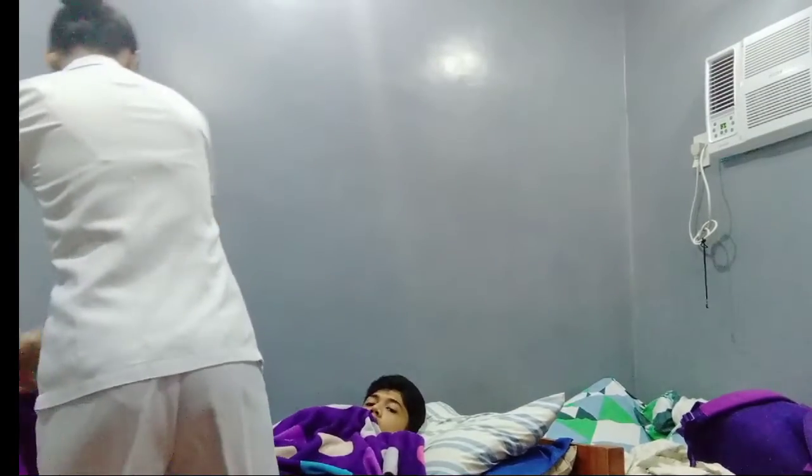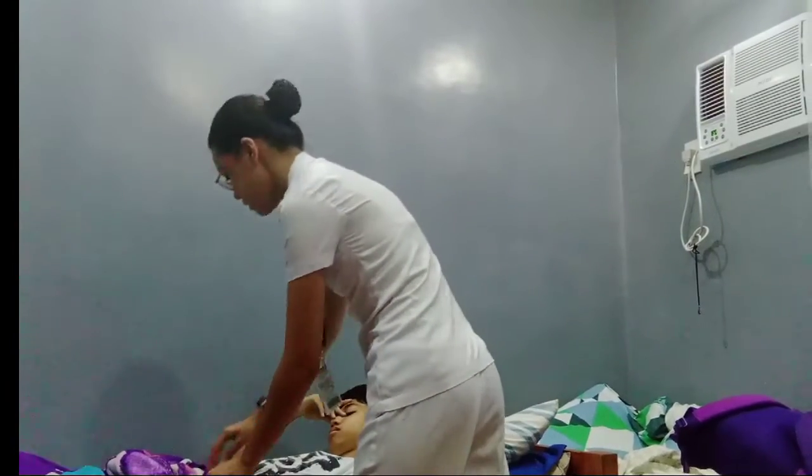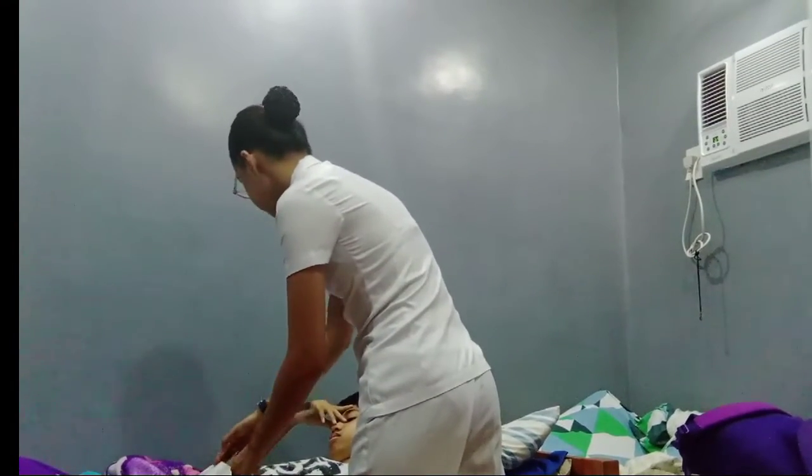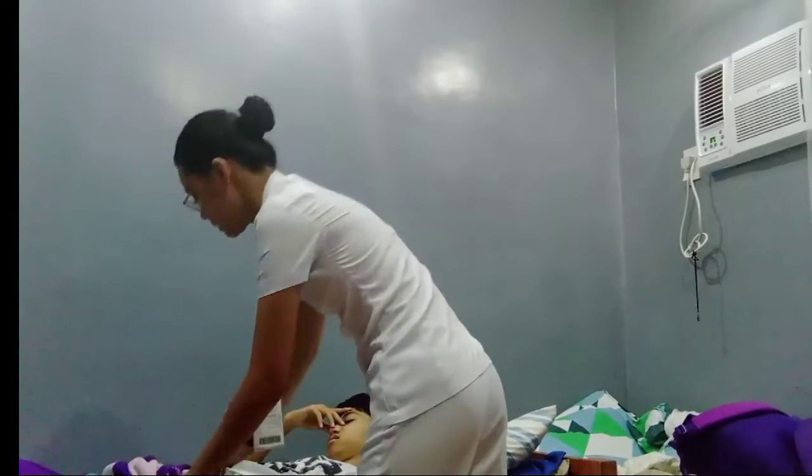Okay, so Hazli, may I cover your lower extremities to make them more comfortable? Okay. Only exposing the part that needs to be injected. May I open your cloth and expose your abdomen? Thank you so much. Okay. Palpate the site to avoid any area that is tender.